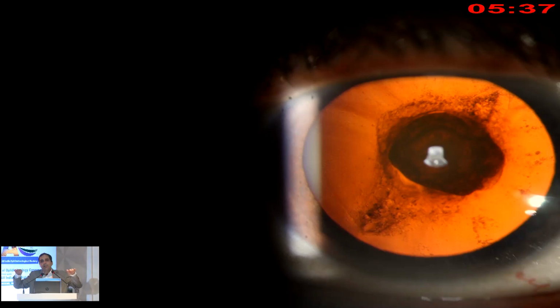So inject more in the mid periphery so that there is not too much pressure, and you can approach it appropriately, sir. Thank you so much.